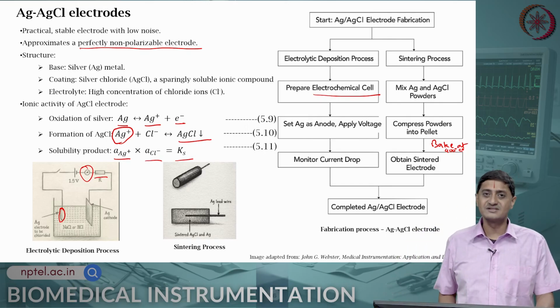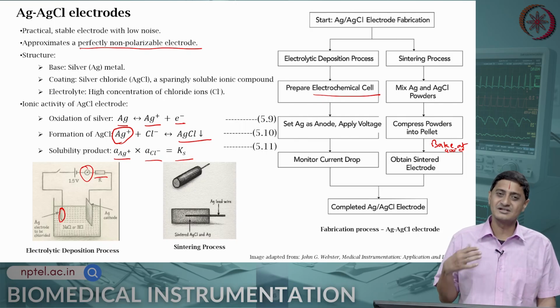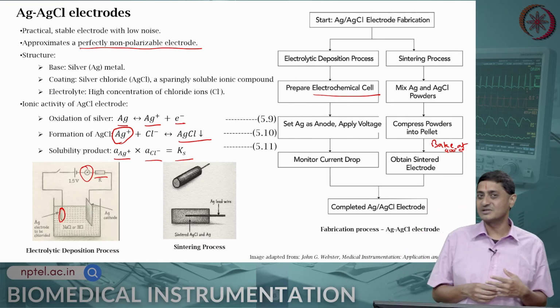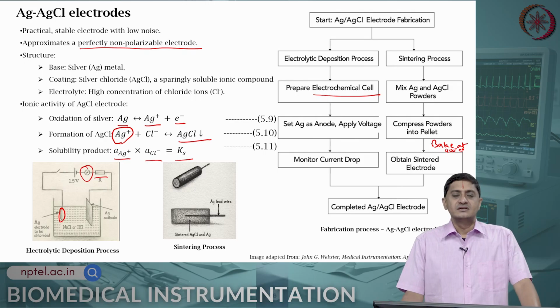This is the point that I was saying previously, that it is not essentially a full short circuit. In fact, the full short circuit is not a desirable situation. There should always be some resistance, and I mentioned why, because of charge transfer, in the previous set of videos. Note that silver chloride is sparingly soluble in water or other fluids.